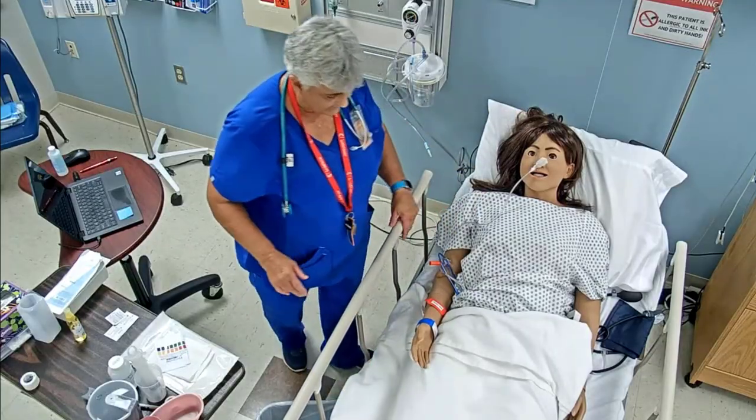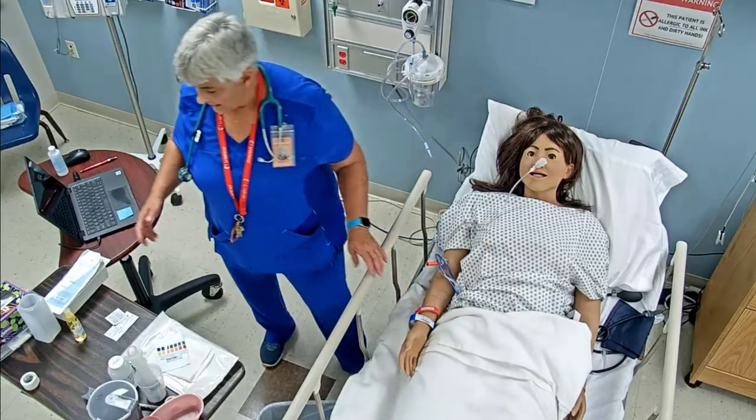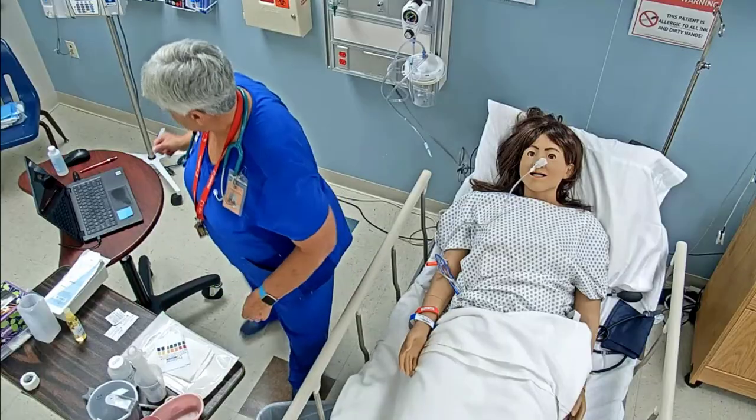So we'll wait for that chest x-ray. We've already called for help with that. And I'm going to make sure that I clean all of my stuff up.